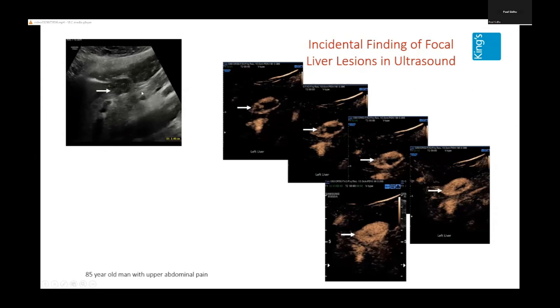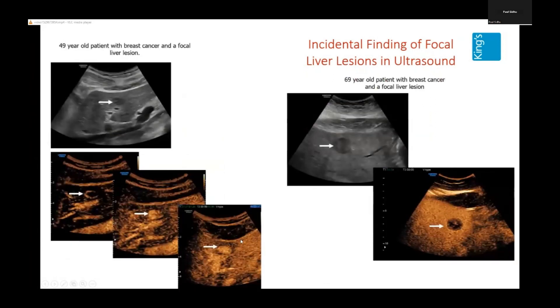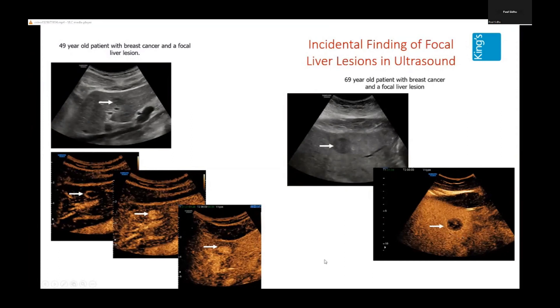Here is another patient — 85 years old with upper abdominal pain — always a chance this is going to be malignant. But again, contrast-enhanced ultrasound shows peripheral enhancement and infilling over time, telling you straight away you're dealing with something benign. Here are two patients in your clinic — both with primary cancer: a 49-year-old and a 69-year-old with breast cancer, each with a focal liver lesion. One shows peripheral globular enhancement and infilling — a benign hemangioma. The other's lesion washes out — it's malignant. Instantaneously, you can direct each patient to the appropriate pathway.